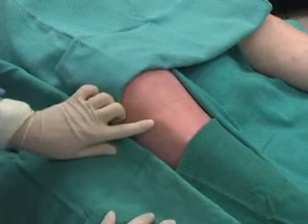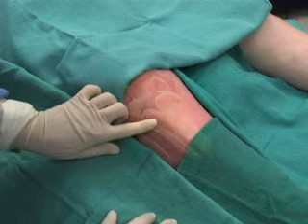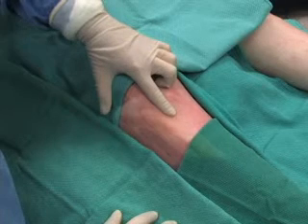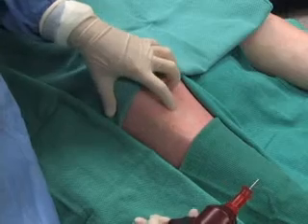tuberosity. The desired insertion site is the flat medial surface of the tibia, medially 1 finger's width away from the tibial tuberosity. Stabilize the leg with the non-dominant hand.